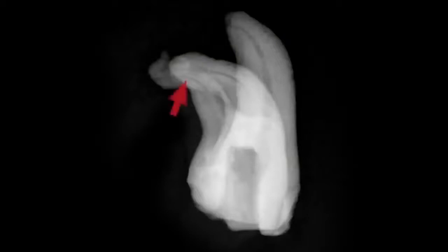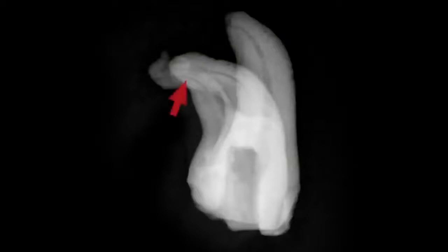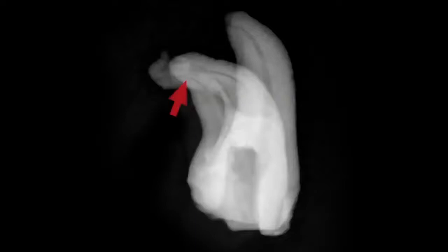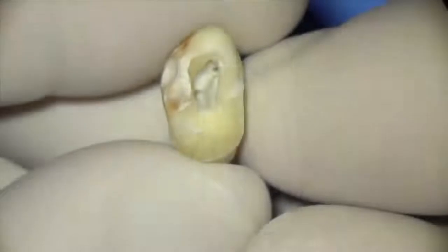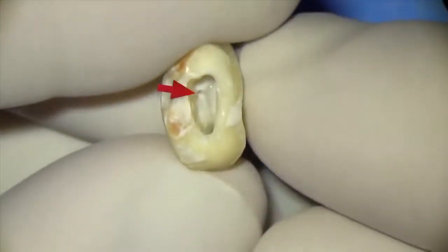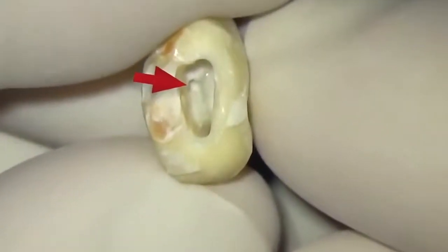Two-dimensionally on the radiograph, we can obviously see one curve, but there are actually two curves to this patient's distal buccal canal. The distal buccal canal has a dentinal triangle which absolutely needs to be removed in order to have straight-line access.